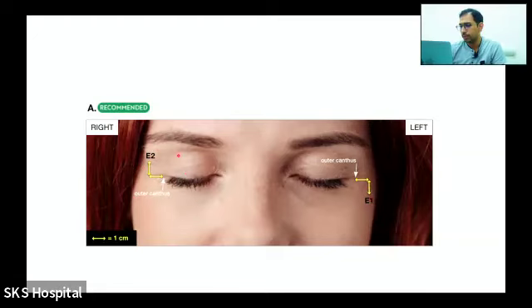When the eyeball moves up, this one will measure the potential, which is increased because it is moving towards this lead, whereas when the eye moves away, it is opposite, which will be scored as negative. To measure conjugate movements, you connect on either side, up on one side and down on the other side.